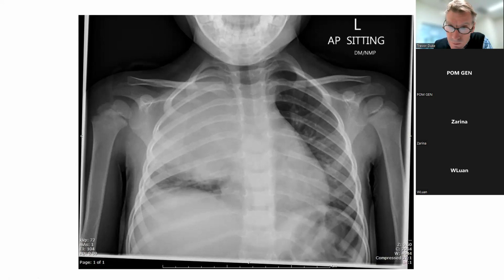Well, diagnostic test. Yeah, well, that's true. Sometimes you can do a diagnostic tap and then do another X-ray and see what you're left with. Because if for example, it's a mass, often there's fluid, and when you drain the fluid, what you're left with is the mass. And you can see it more clearly on the follow-up X-ray.